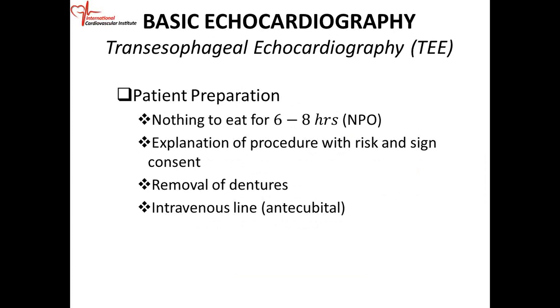You have to get a consent. This is an invasive procedure, so a consent should be obtained. You have to explain to the patient what you're going to do and the risks involved, and then they have to sign the consent. If the patient has dentures, false teeth, you have to remove them, because you can dislodge these and the patient can swallow the dentures. So you don't want that.